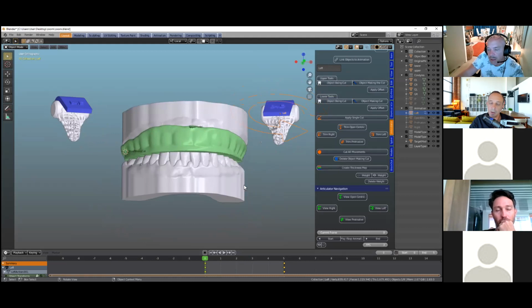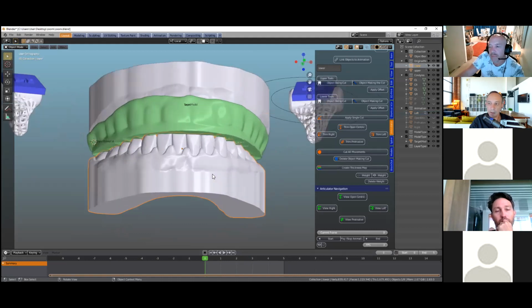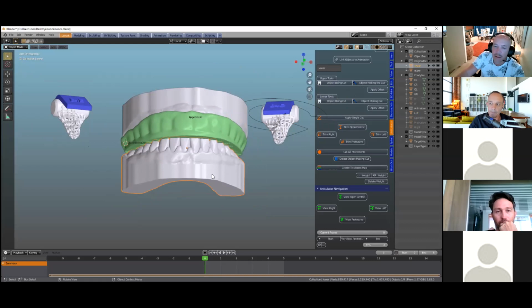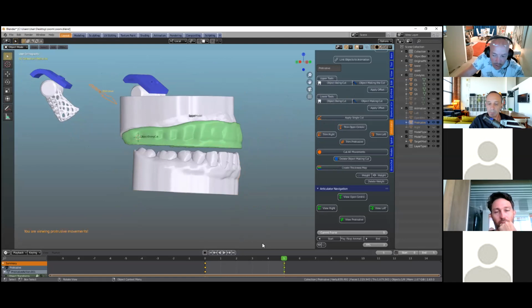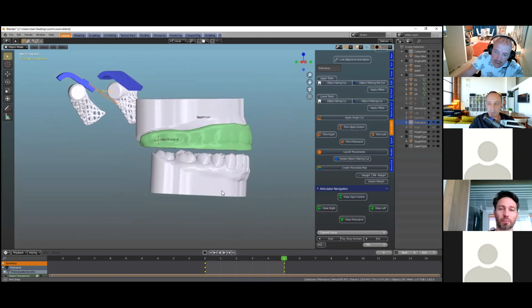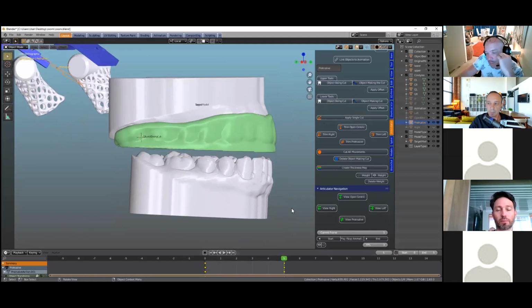Anyway, you could also make just occlusal posterior bite planes with an anterior opening. You've got quite a bit of versatility in how you design your rims, isn't it? We don't have time today to discuss a double splint, which we could do maybe next week or the week after, where we can set the jaw into a class 3 or phonetic bite, whichever.